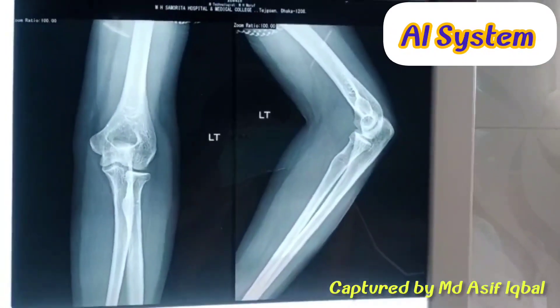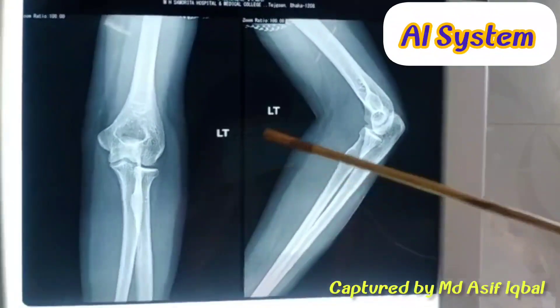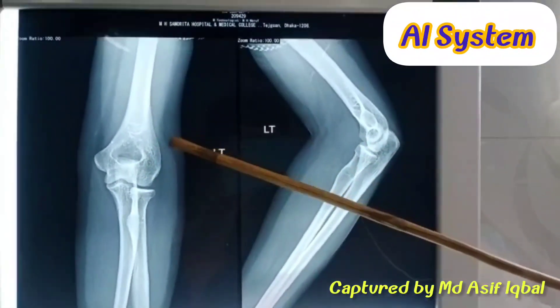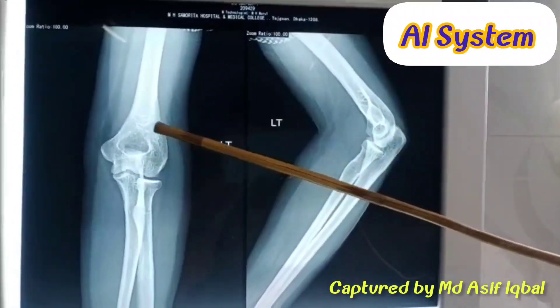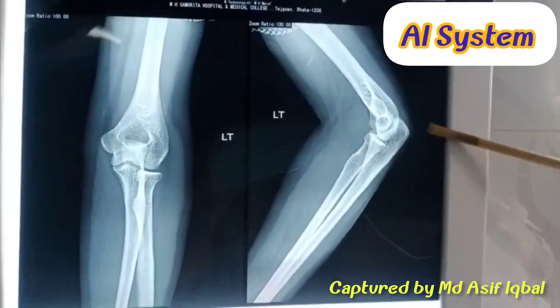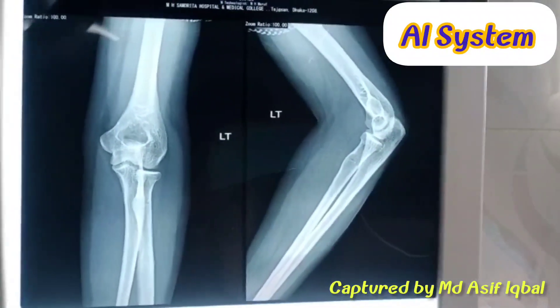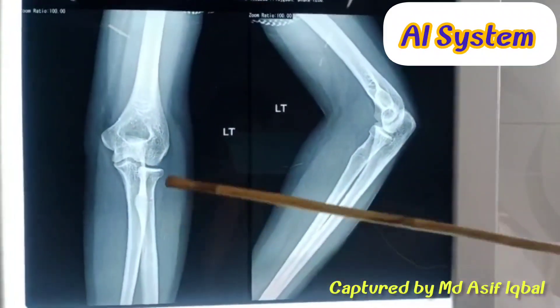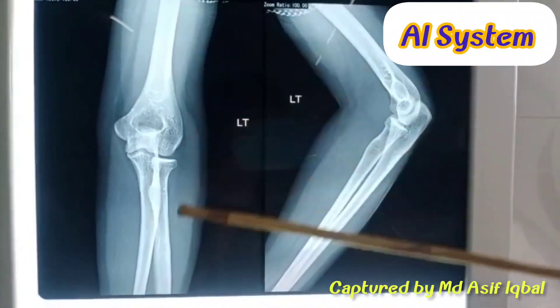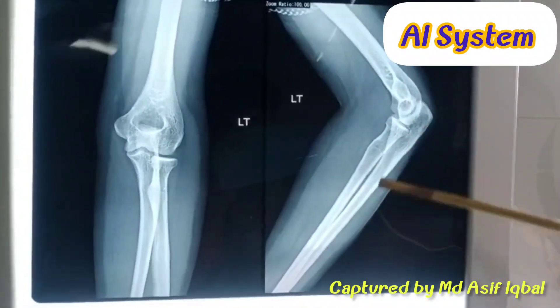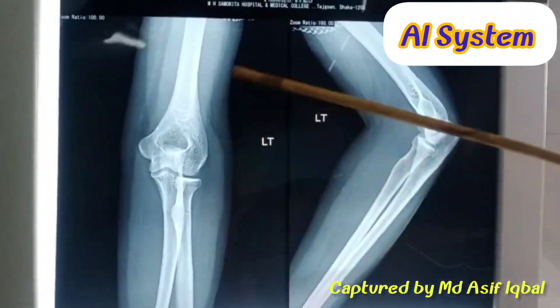Assalamualaikum, dear students. Now we are looking at the plain X-ray film of the left elbow joint. This is the anteroposterior view and this is the lateral view of the elbow joint. In the plain X-ray we can find the impressions of the bone and the soft tissue — that means muscles, vessels, nerves — these are the impressions of the soft tissues including skin.